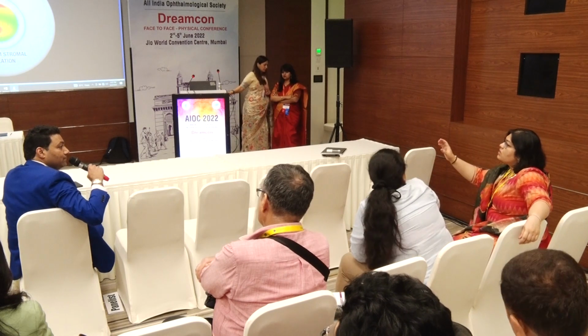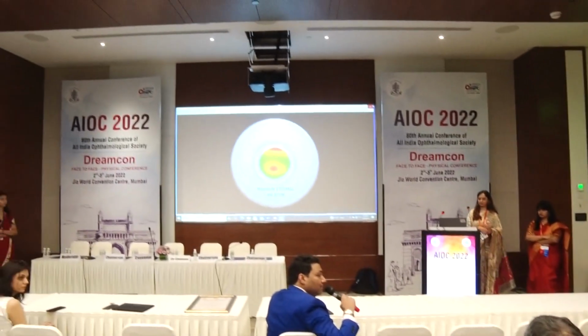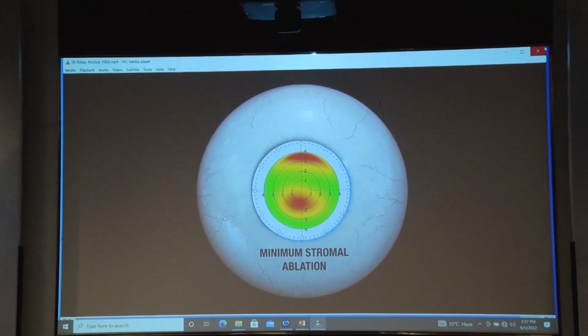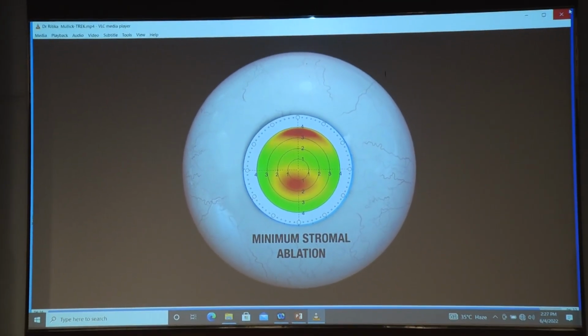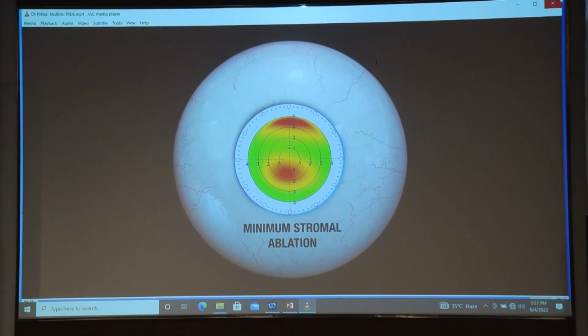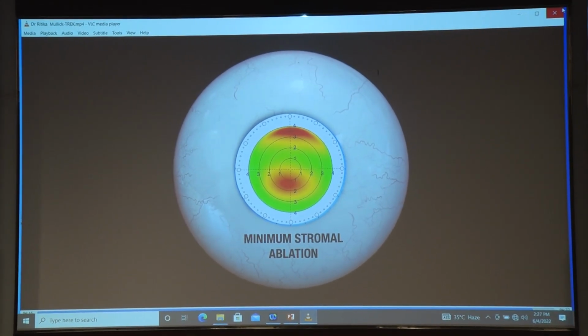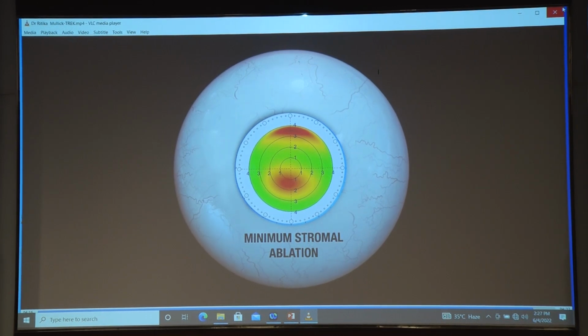Sometimes you see that it's more or less a bow tie, but it's keratoconus. You do a PTK of around 7 millimeters on them. You see how beautiful the results are. When I see a bow tie, I don't want to do a laser. I just do a 7 millimeter PTK. It shaves off all the irregular ups and downs, and you see a beautiful result.